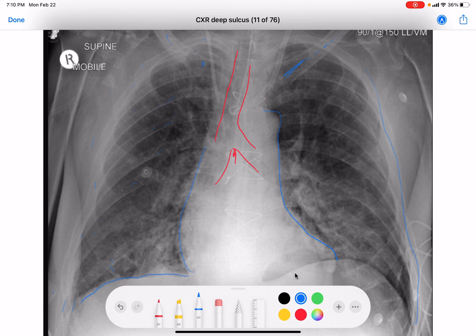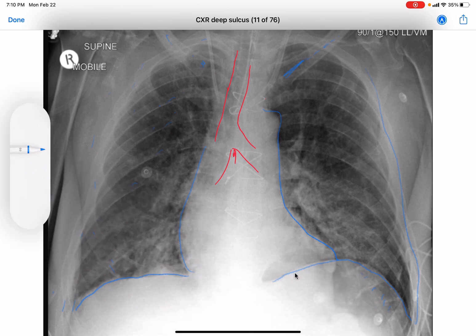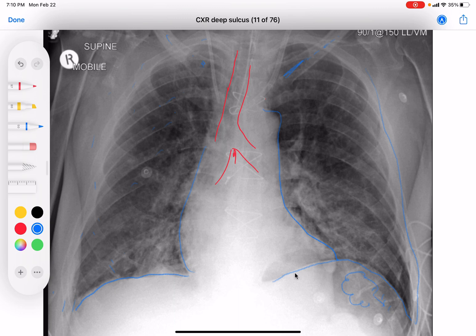D for diaphragms. Right diaphragm looks fine. Left diaphragm looks kind of funky though — you can trace it here. You can see how lucent this is, all this lucency in here, and how deep this goes down here as well. You can actually see the border of the heart through there, which you should not be able to see — this should all be blocked by the diaphragm and stomach. This is a particular sign called the deep sulcus sign.